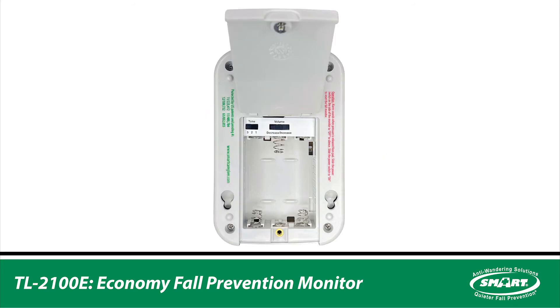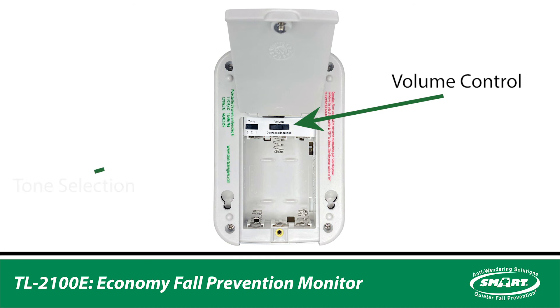Inside the battery compartment in the back of the monitor, there is the volume control and tone selection.